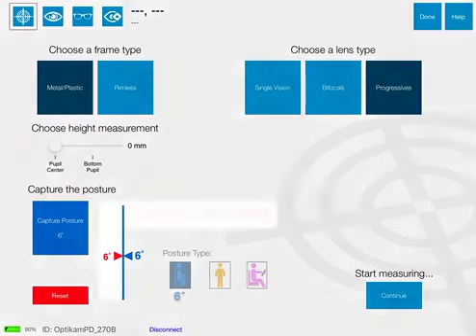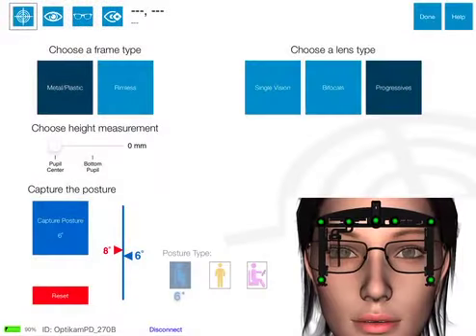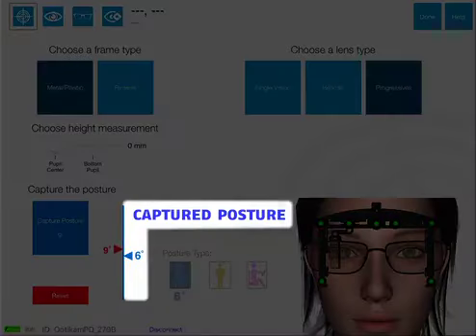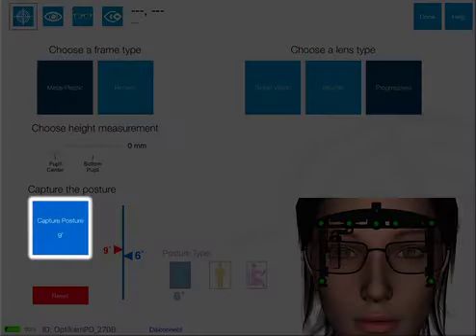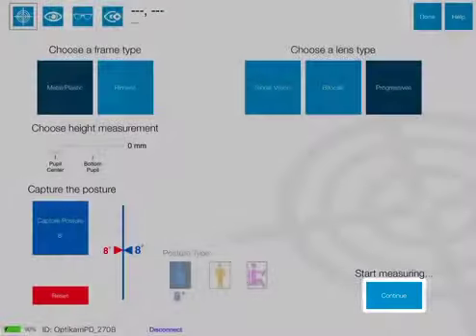If you notice that the live pantoscopic tilt reading represented by the red arrow is consistently different from the captured reading, which is represented by the blue arrow, you can override it by touching the Capture Posture button again. This mimics what experienced opticians do after dotting the lens and observing the mark on the lens in relation to the eyes as they talk to and observe the customer. Touch the Continue button when ready.